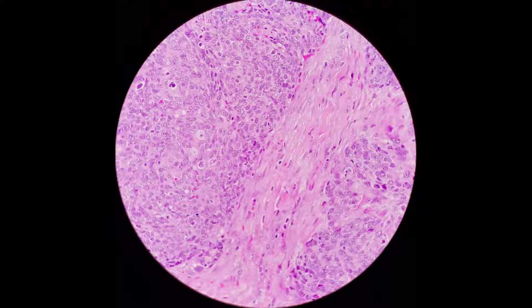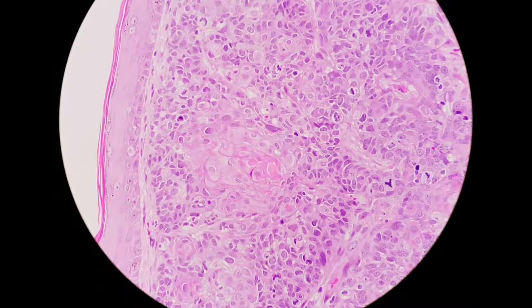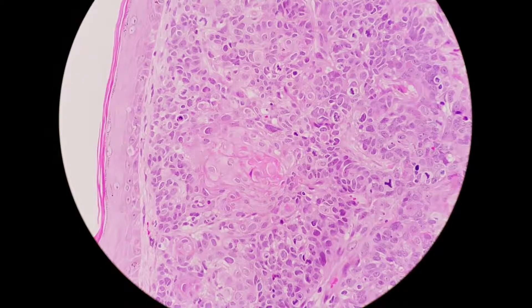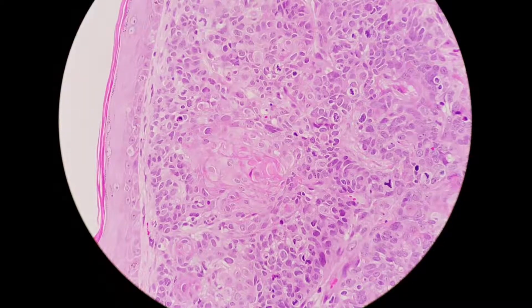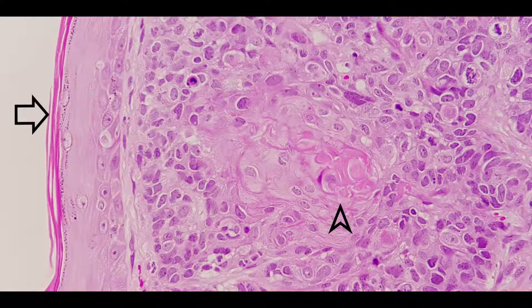I have highlighted the area of the malignant cells and the stroma for easier understanding. To diagnose squamous cell carcinoma, the most important criterion is the production of keratin. Here, we can see that there are a few cells producing keratin.